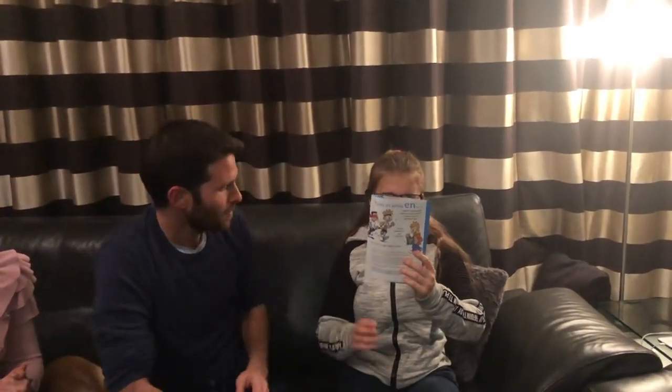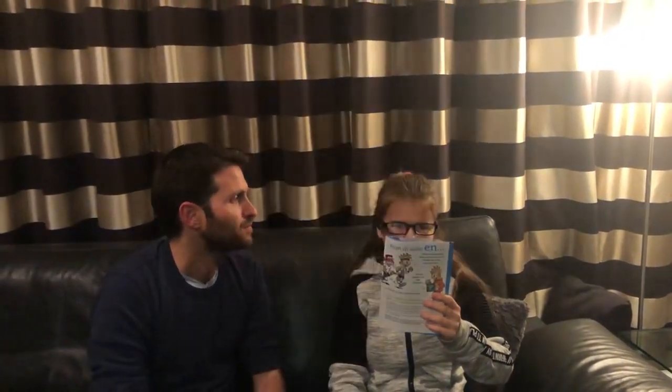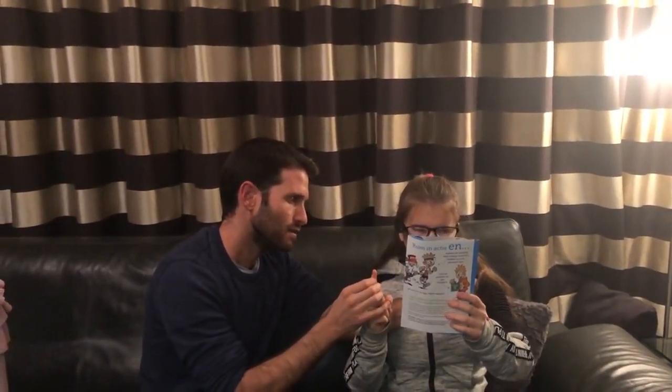Hold the page in front of you. Now take your finger — this one — and press. The camera takes a photo of the whole page. Maybe you can take it a little bit further.